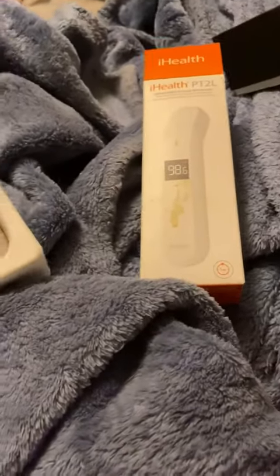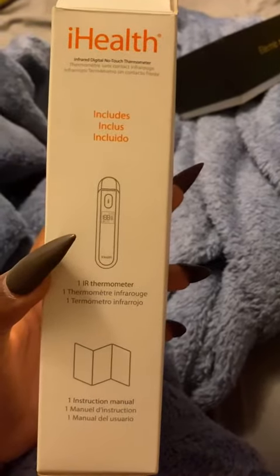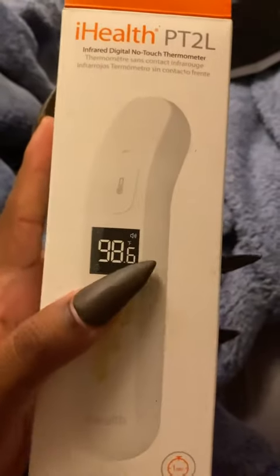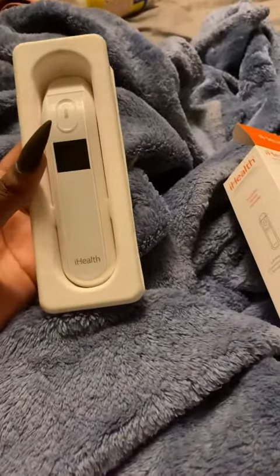I don't believe it changes colors — I think it just shows what temperature it is on the front, and probably puts up some kind of little face. Yeah, a happy face or sad face depending on how high your temperature is, just like it shows on the guidebook here.